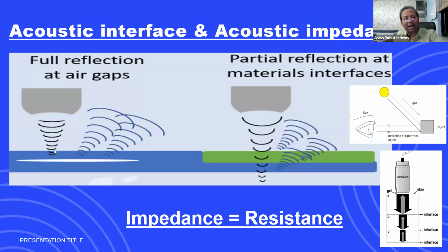There is some air gap, and the sound wave came up to the air gap. Air gap means, say inside the muscle, due to something you have made one injection of some air. By ultrasound, if you see at this level, all the sound waves will get reflected. So what will happen if everything is reflected? You will see this area as bright white, very hyperechoic, and you cannot see anything beyond that. This happens with the bony margins also. The impedance of bone is so high that all the sound waves are reflected.